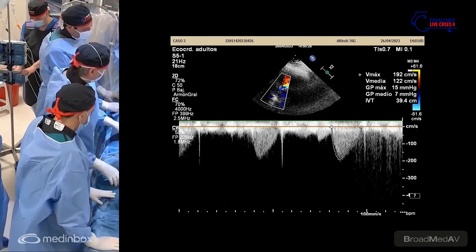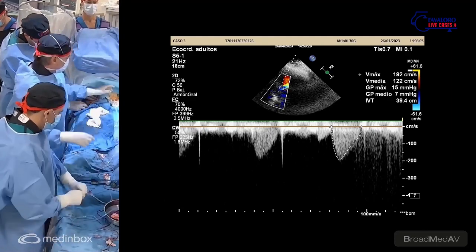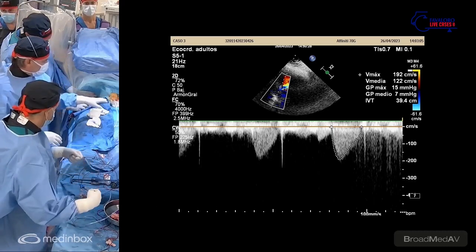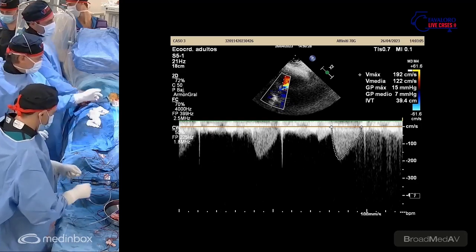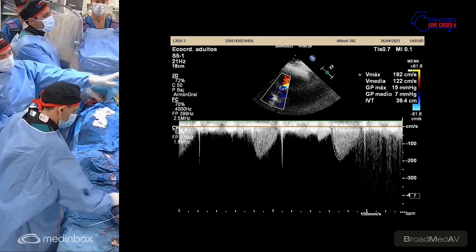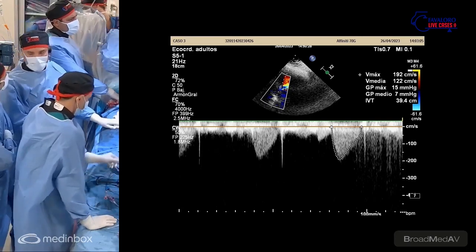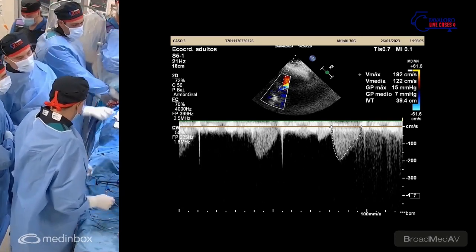No bleeding at all. So guys, our job is done here. Dr. Carlos Fava is going to fix the pacing wire for at least 12 hours, and we will pull out the contralateral sheath. Quite frankly, although we don't have bleeding, we still compress probably for an additional 10 minutes. Good, excellent. It's just a safety measure. And Carlos is going to suture the skin.